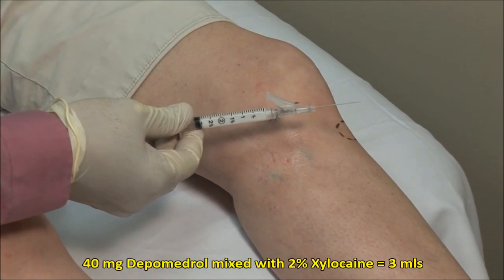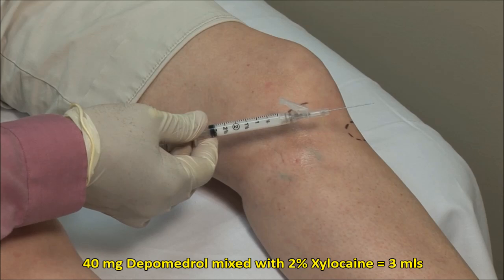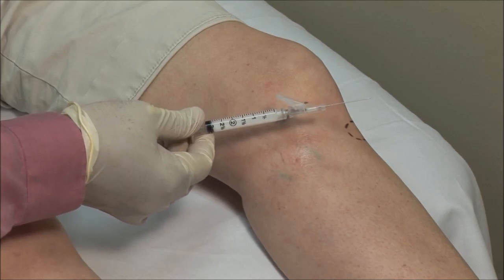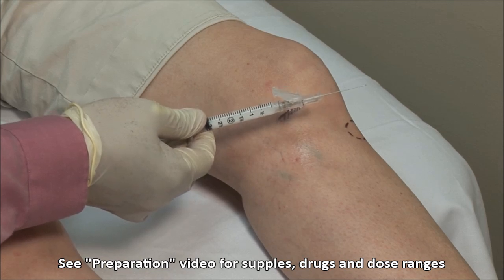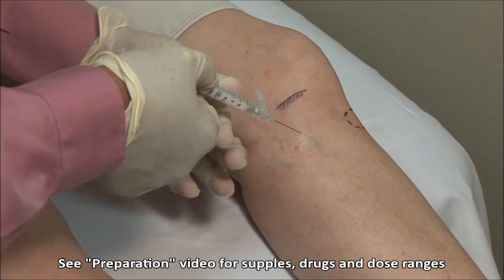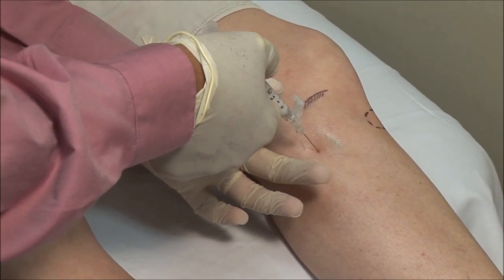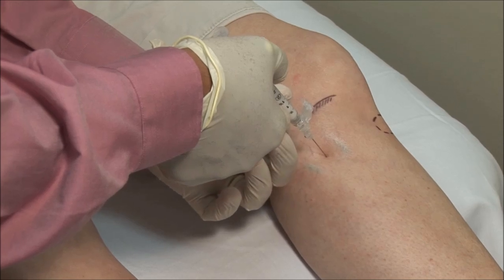Here I have a mixture of 40 mg of depometrol mixed with 2% xylocaine without epinephrine to a volume of 3 ml, and I am using a 22 gauge, 1.5 inch needle. Advance the needle perpendicular to the tibia, down to bone, and then withdraw about 2-3 mm.